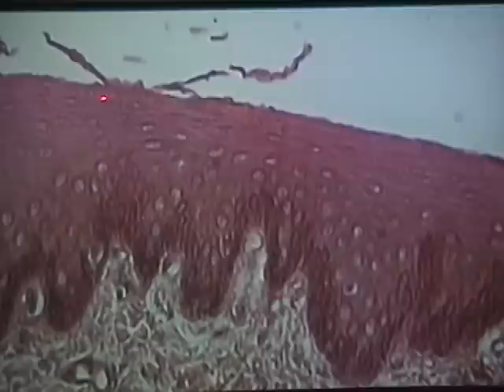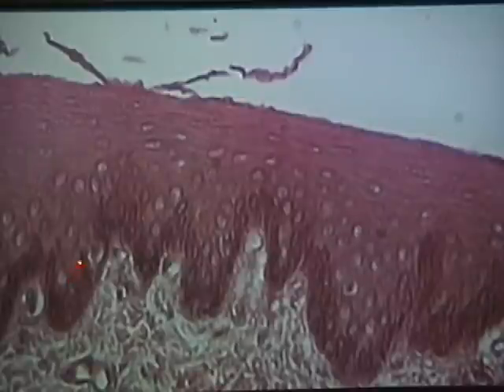And because this type is non-keratinized, it's also important in maintaining a moist environment. With stratified tissues, the shape is derived from the uppermost cells. So although these deeper cells may appear more cuboidal, as you work your way up, you can see that the cells are becoming flatter. And so regardless of the shape of the cells down deep, the uppermost cells are squamous, hence the name stratified squamous.